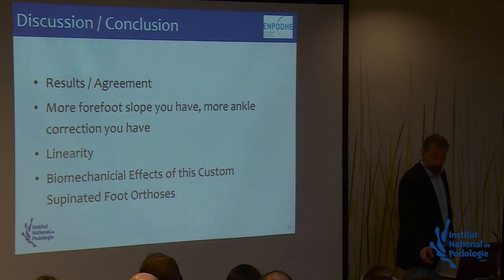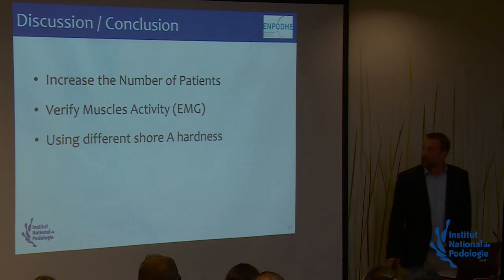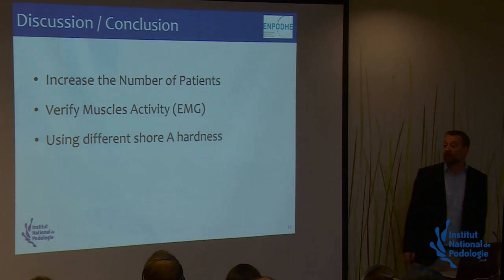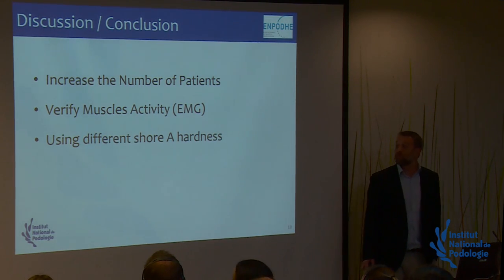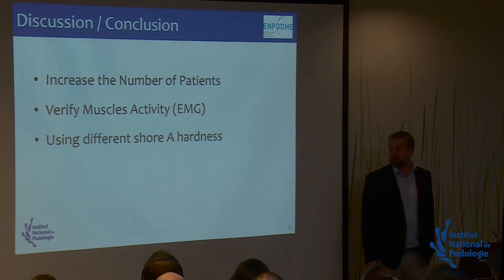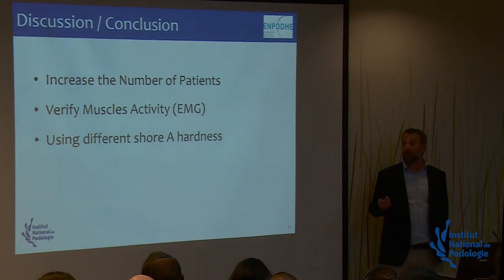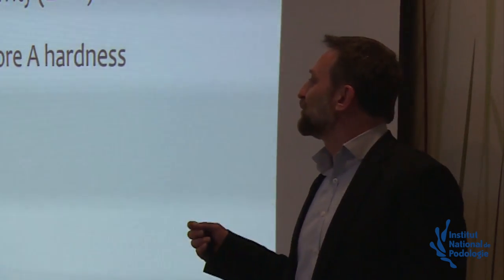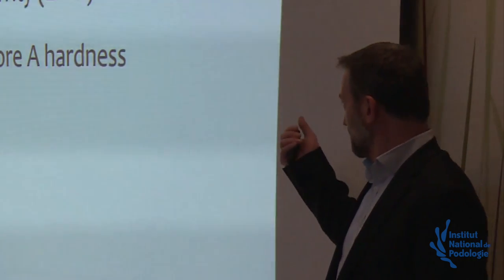What I have to do right now is, of course, to increase the number of patients, because with 5 patients I can't have any conclusion, to verify the muscular activities, and I also have to use different Shore A hardness. It means, that's correct with 70 degrees Shore A hardness, but what is the effect when there is only about 15 or 50 hardness? Because using a supination forefoot pad means to have a first metatarsal head which is available to have this action and this height and this hardness.